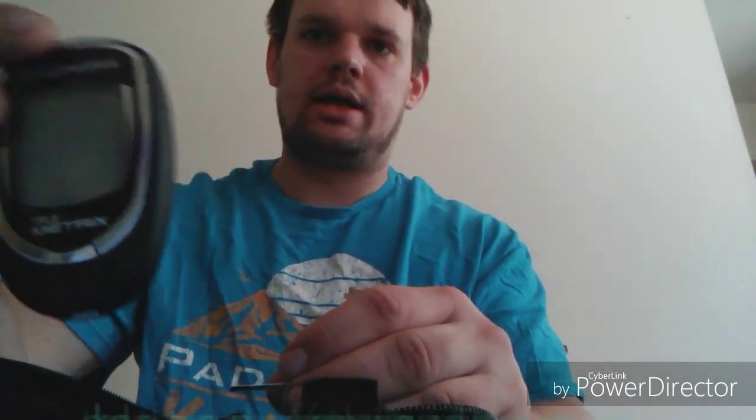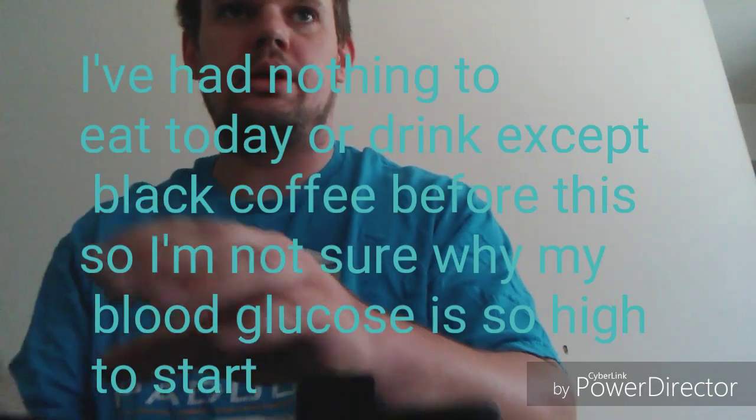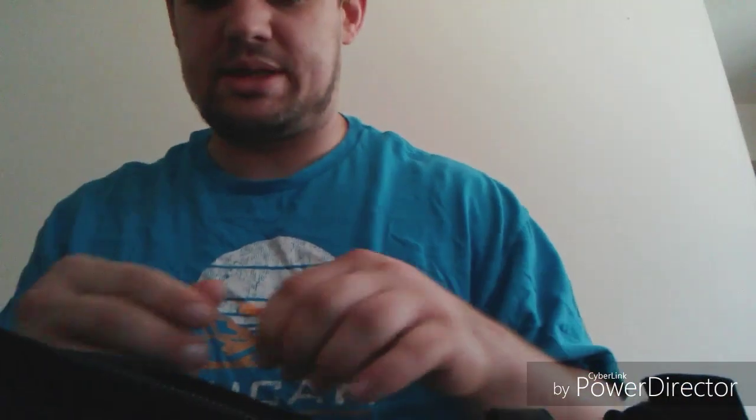So what I've got here — we are going to test. And I am not diabetic at all. I just have this for research purposes to test different things, to see how they affect my blood glucose levels. Because I don't want things that are going to affect it to an extreme level. And theoretically this shouldn't affect it at all, but we will see if it does or not.